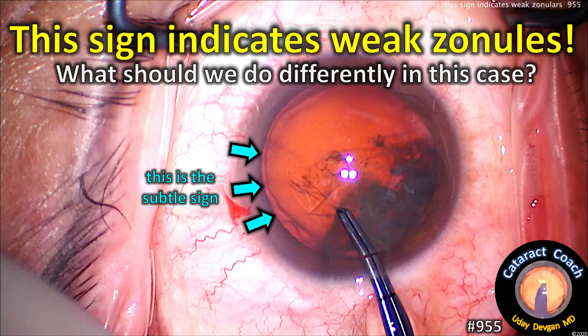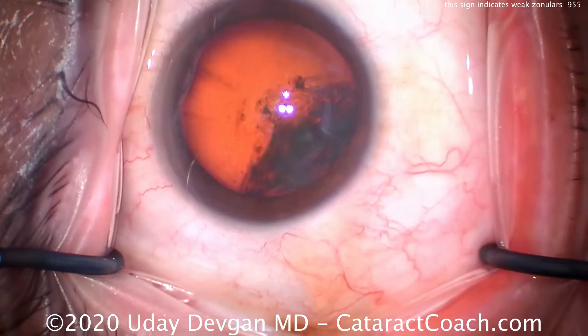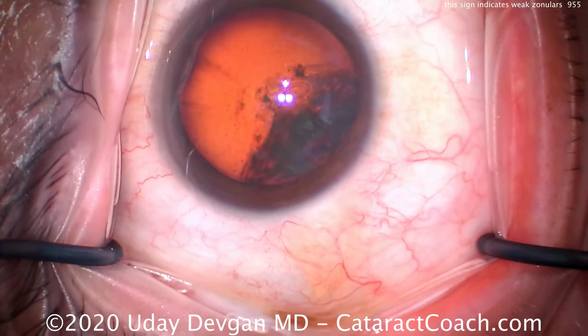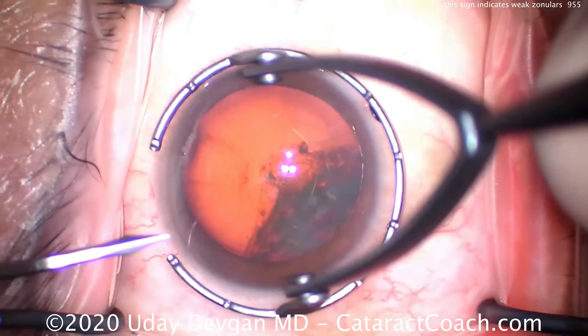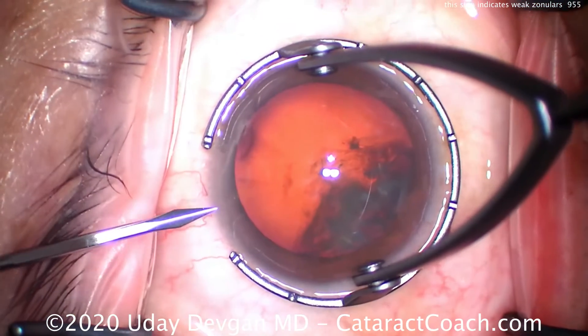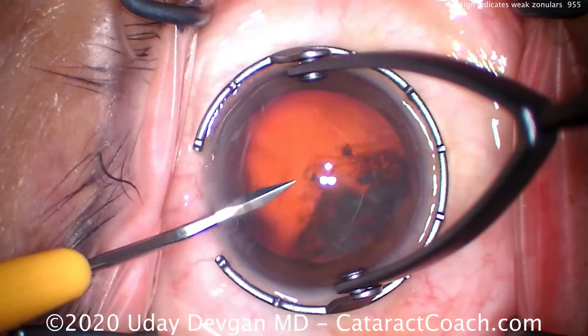From cataractcoach.com: this sign indicates weak zonular support, so what should we do differently in this case? There's that subtle sign. Let me show you the surgery. We think it's a pretty routine cataract surgery — the patient's a little myopic but no prior trauma. We make our incision here.